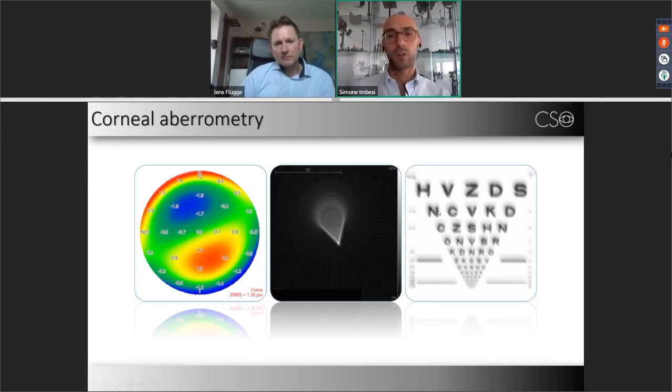The effect of coma on the visus is really disturbing, because this aberration causes some blurs close to the letters, as you can see from the simulation of visus, and it's pretty hard to correct, because as I told you before, we cannot use spectacles. So the only way to correct this aberration is to regularize the surfaces affected by coma.